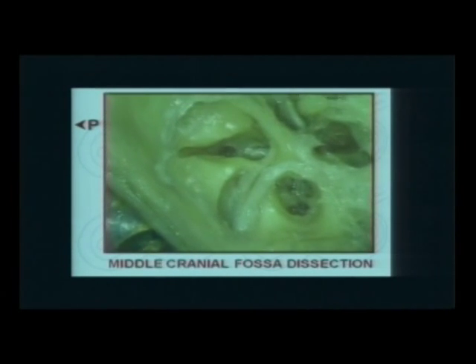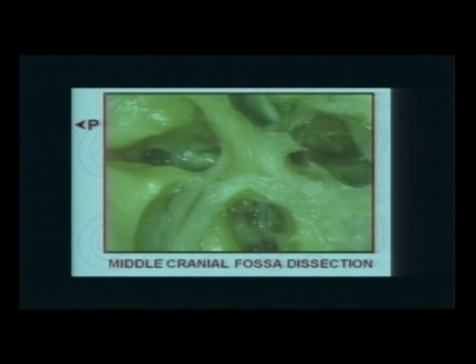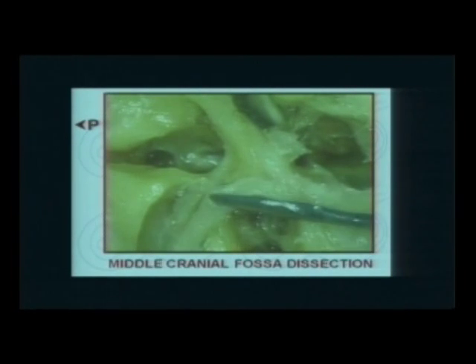And here's the internal auditory canal. This is the beauty of the microscope, that you can see your map, and now we have carried out surgical mapping where we showed all the structures which are present inside the temporal bone. I like especially to stress on that. Your eyes should take care of the facial nerve: internal auditory canal, labyrinthine, first genu, tympanic part, second genu, and then the mastoid part going all the way down to the stylomastoid foramen.